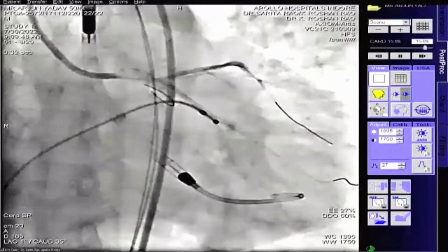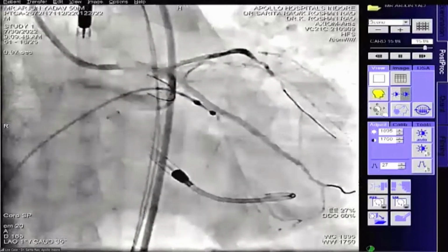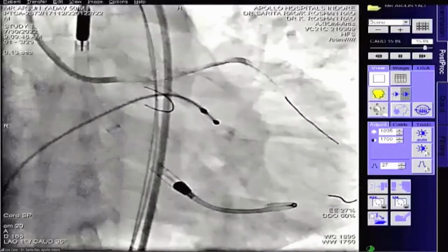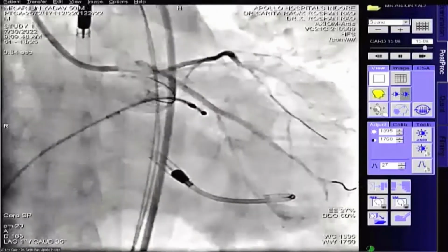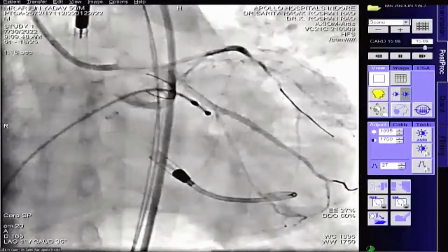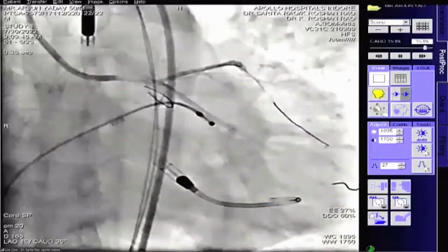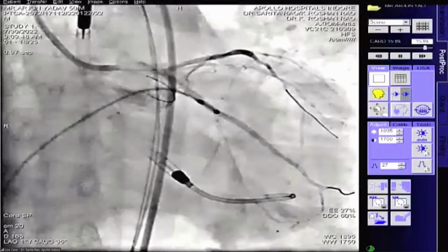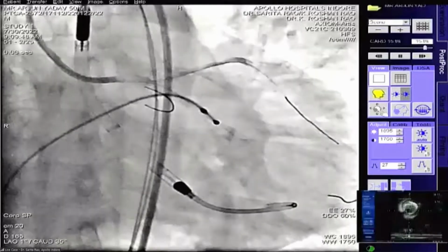So you can take a 3.5, I guess. That may be a better choice because you have to do a POT and then you have to POT the LAD, the left main again. So how much, in your opinion, Dr. Bansal, can a 3.0 go up to? There are stents which can go much up, up to 5 also. But you shouldn't use 2.5 for sure because that will not go up to 4.0. So 3.0 can go up to 4.0.